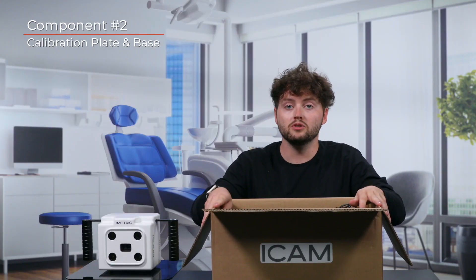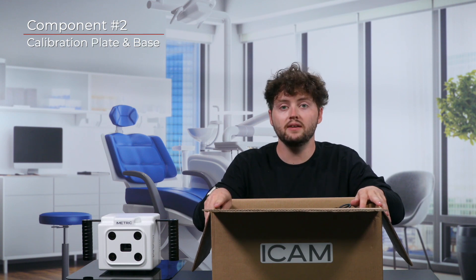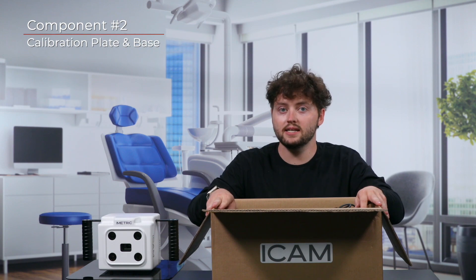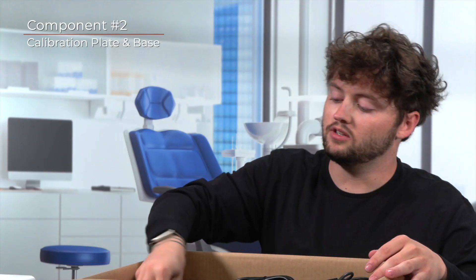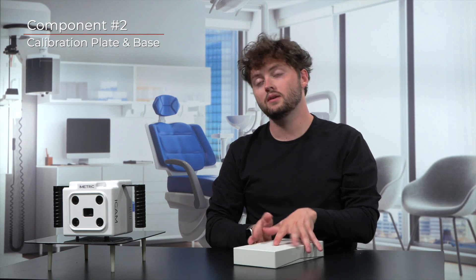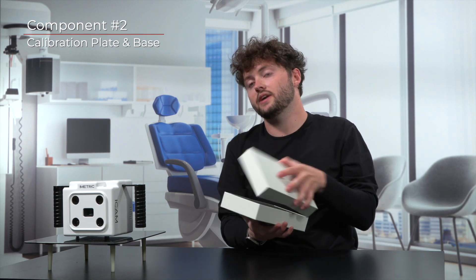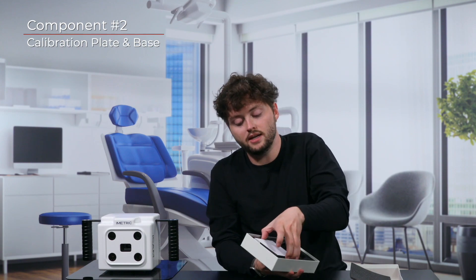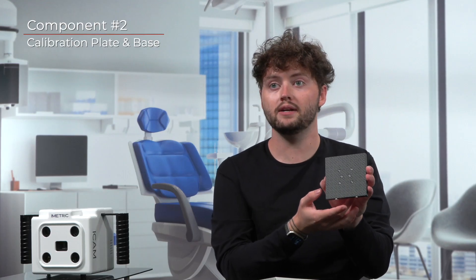Next up we have one of the most important components to any photogrammetry unit on the market. You can find a white box located inside the shipping box on the far right side. This white box holds two items: the calibration plate and the calibration plate support. Let's carefully take out the calibration plate. The best method is to grab the sides of the plate itself. It's important not to touch the side of the calibration plate with the white dots.